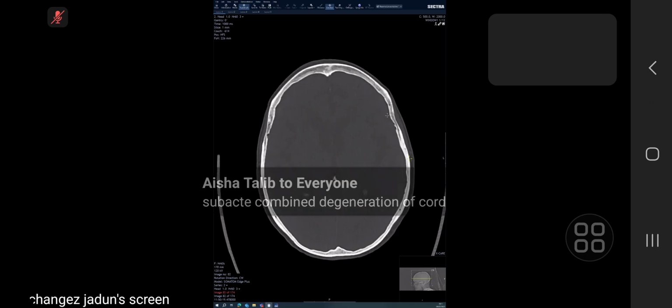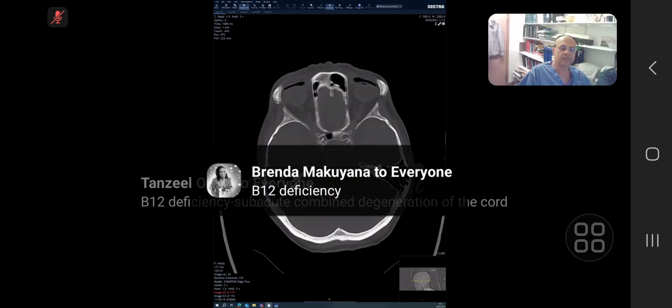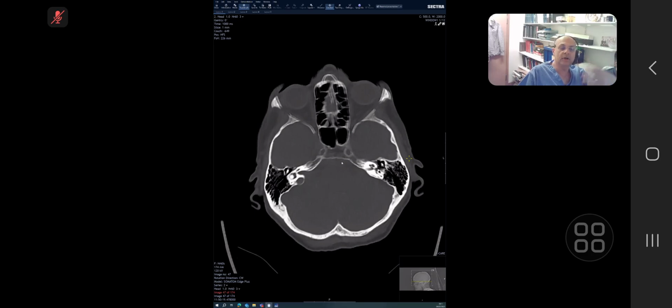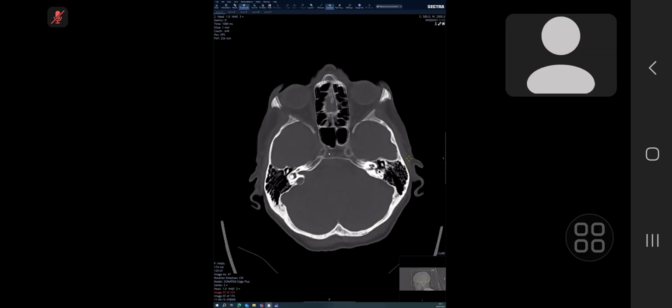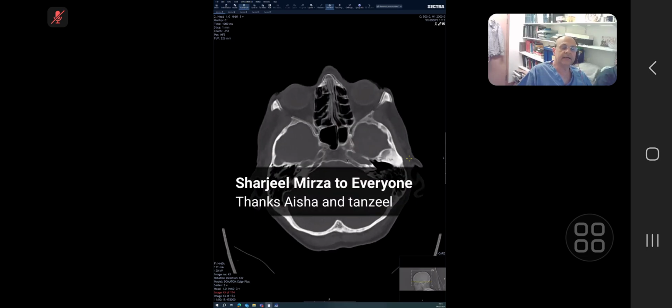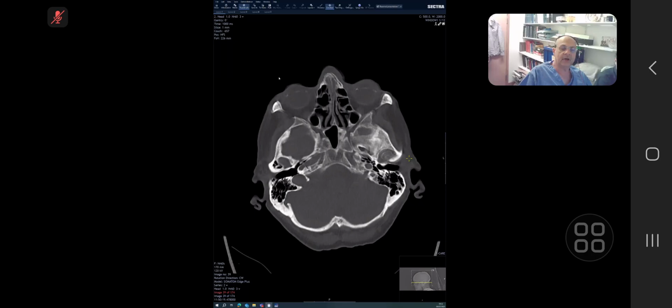I'm looking at the frontal sinuses. I'm looking at the orbits. They look normal. So you are telling the examiner what you are looking at, because the examiner does not know what your brain is thinking. Then I would say I'm looking at the ethmoid and sphenoid sinuses. So I'm just concentrating on the front half of the calvarium.